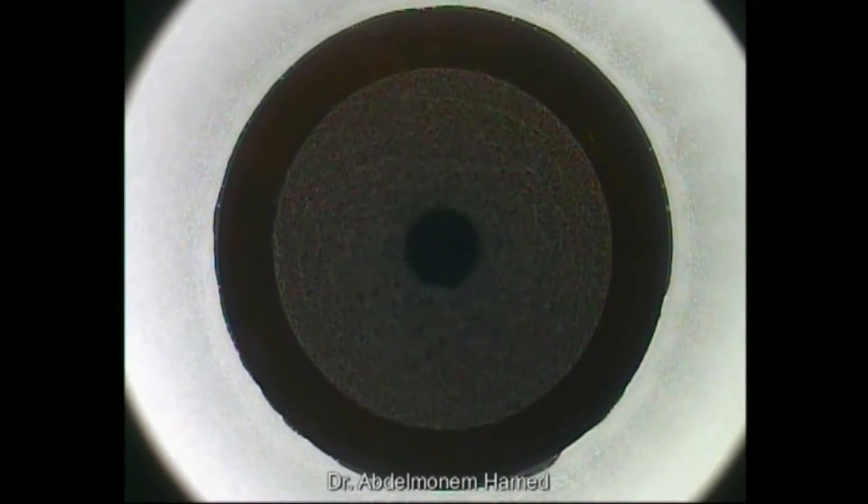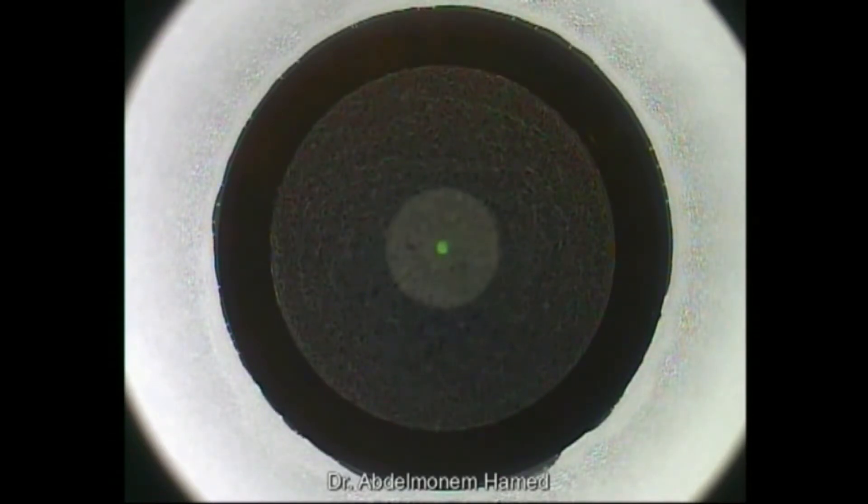Small incision lenticule extraction with dual incision. A primary entry incision of 3.0 mm has been centered at 120 degrees, and a secondary draining incision of 3.0 mm has been centered at 270 degrees, positioned at the most dependent site with gravity for better evacuation of the pocket.